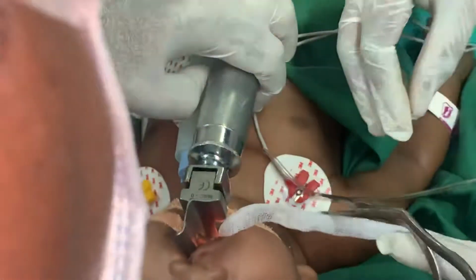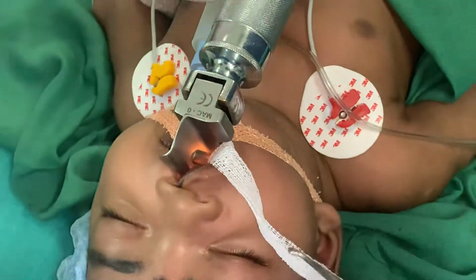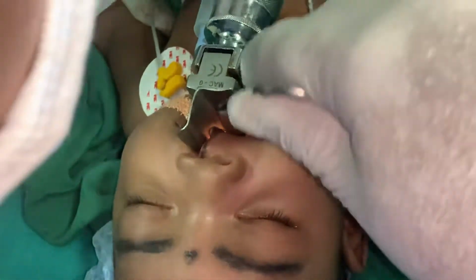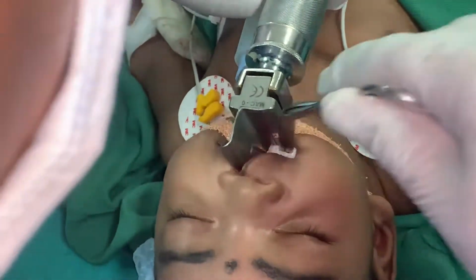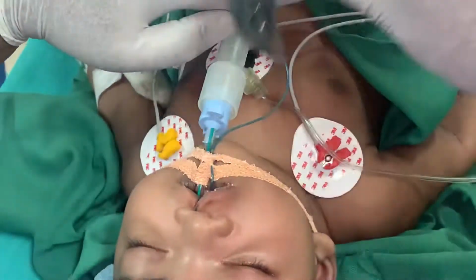Hold it up. So even though we have a cuffed tube, and even though it's not a cleft palate, it's still safer to put in an extra throat pack because we wouldn't want even a small drop of blood to stay in the throat.